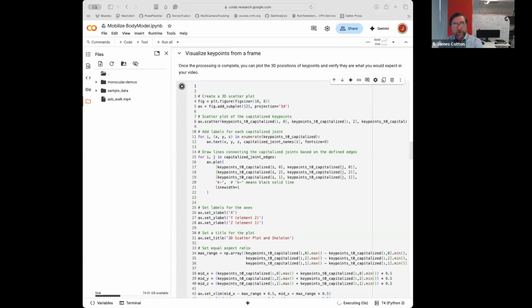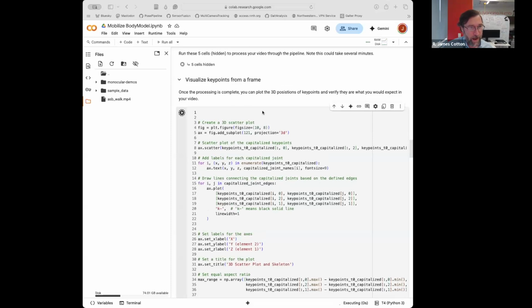If you're doing surgical decision making and you're going to cut apart a child and move their muscles and rotate their bones, I think you should probably have the most accuracy available, and I don't think markerless is there yet. So it partly gets into the spectrum of what your question is and what technology you need, and that's my general answer to a lot of questions around accuracy.